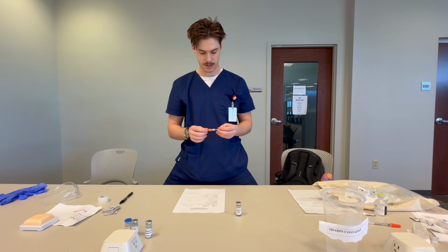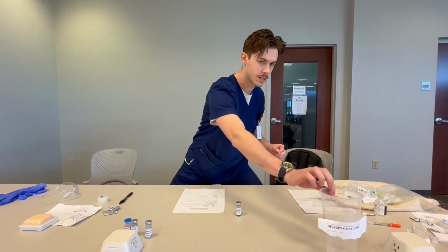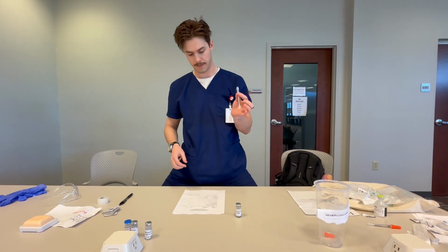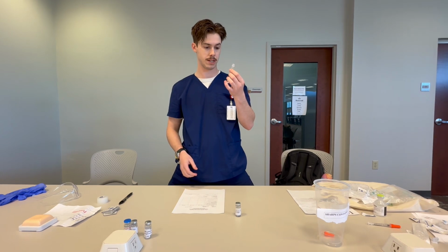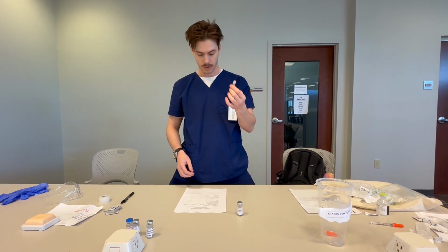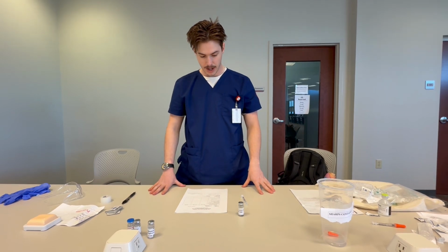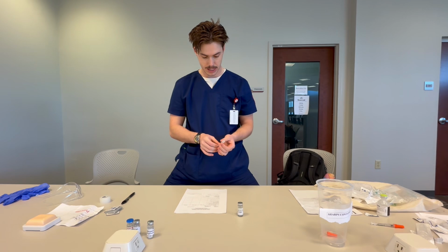All right, take the cap off. The sharps container. All right, safety up. And check. This is the proper needle for a subcutaneous injection, which is proper for this procedure.